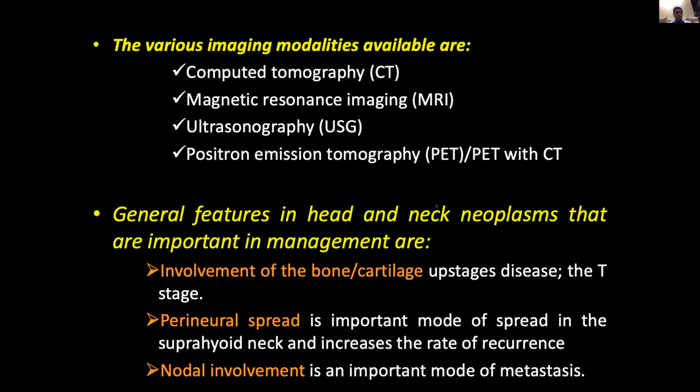So there are various modalities ranging from computed tomography to MRI, ultrasonography, and PET-CT. We will see the pros and cons of each modality, and which modality is suitable for which particular cancer we will see in the specific cancer type.